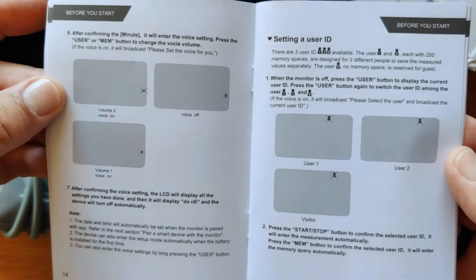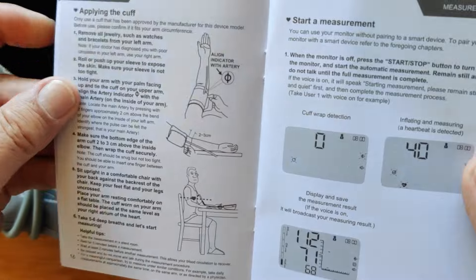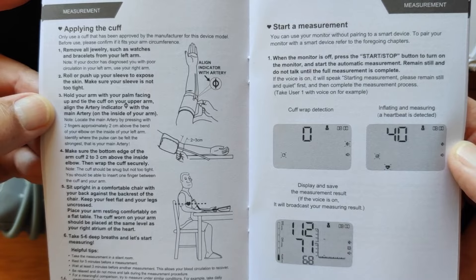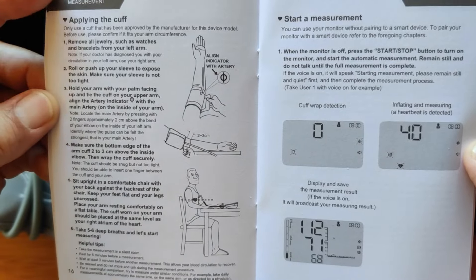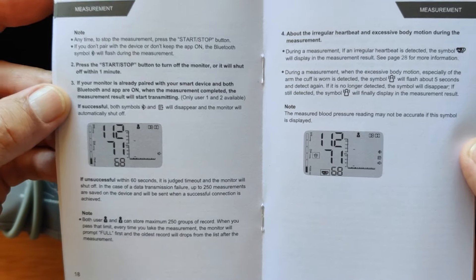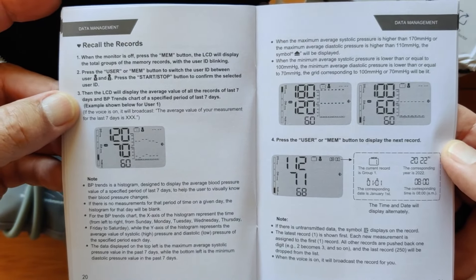You can set up two users, and it will record up to 250 different readings each. A guest can also come in, hit the button, and take a quick blood pressure reading without storing the data. The manual also covers how to set the cuff up, how to position yourself, and how to do the measurement. It also shows you how to recall your stored records.